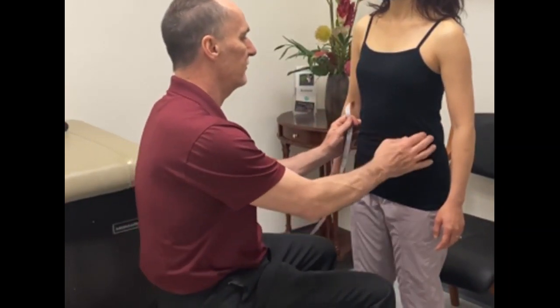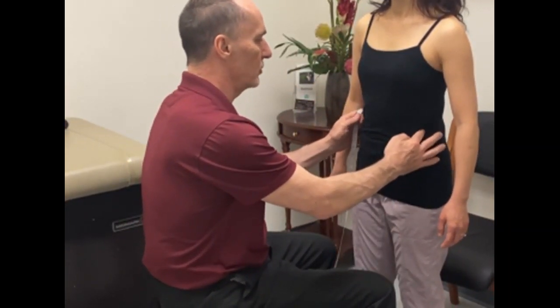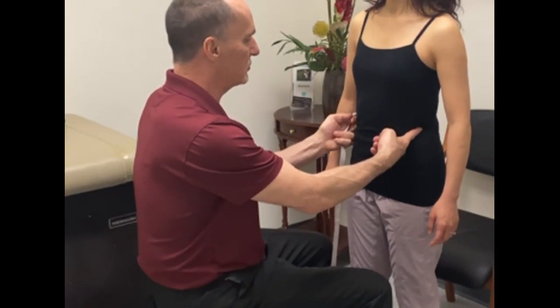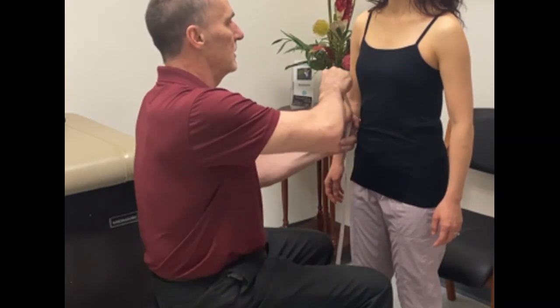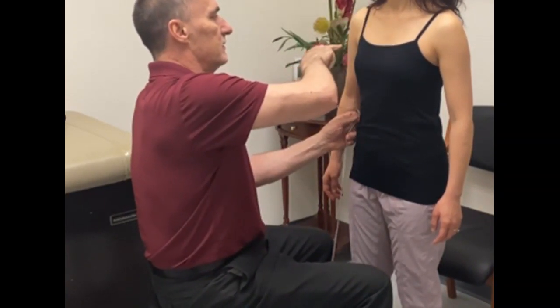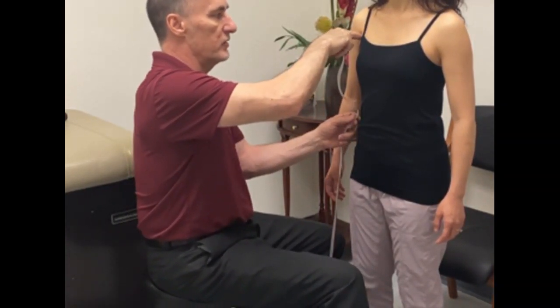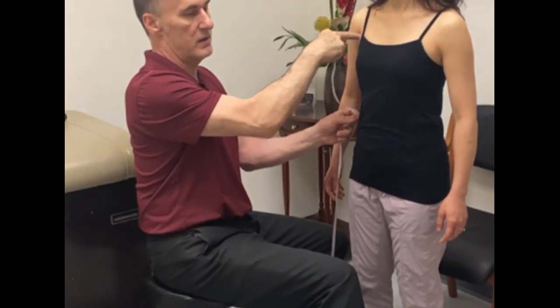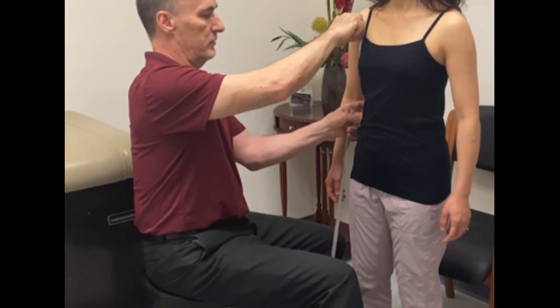You also need to take two length measurements. First, measure from the waist up to the axilla. That same point where you took the waist circumference measurement is your bottom point, and your top point is the anterior aspect of the superior aspect of the axilla. Measure from that point down to the waist.